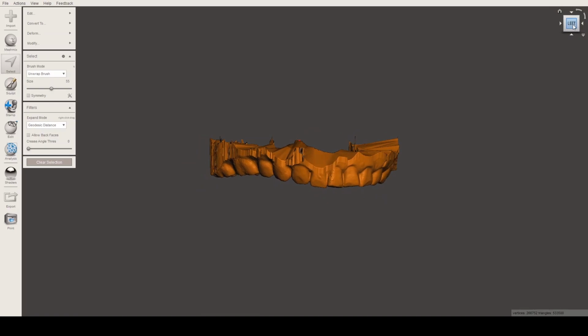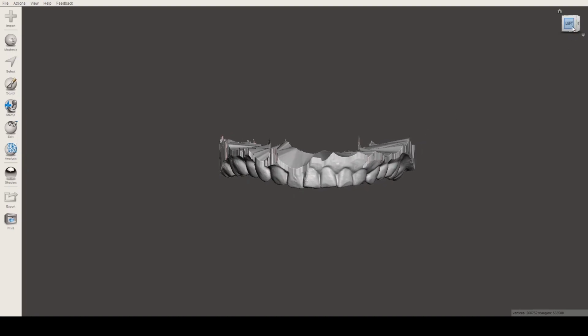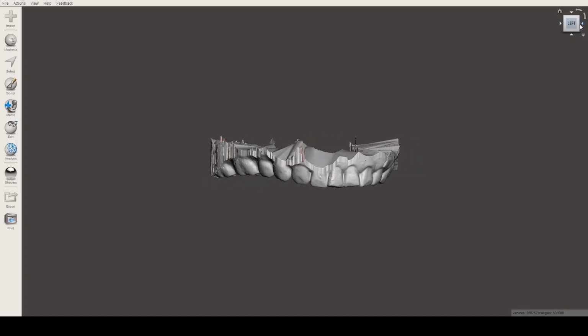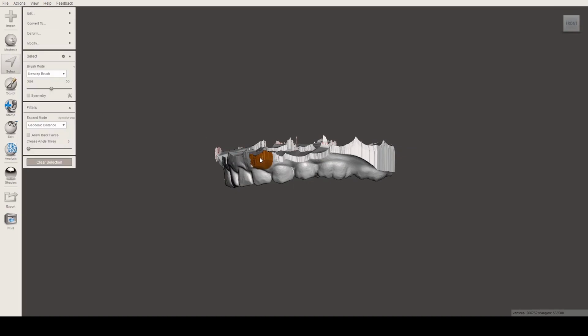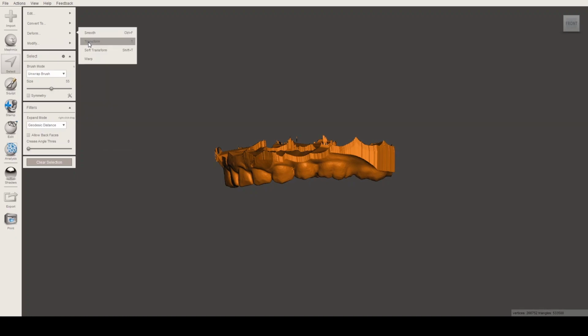Now that it's done, okay, that's the left. Now we didn't quite transform it the way we want it to be. Oh, okay. But it's much better now. That's the front. We want to move it. Let's move it again. So double click, select and double click, deform, and then transform.